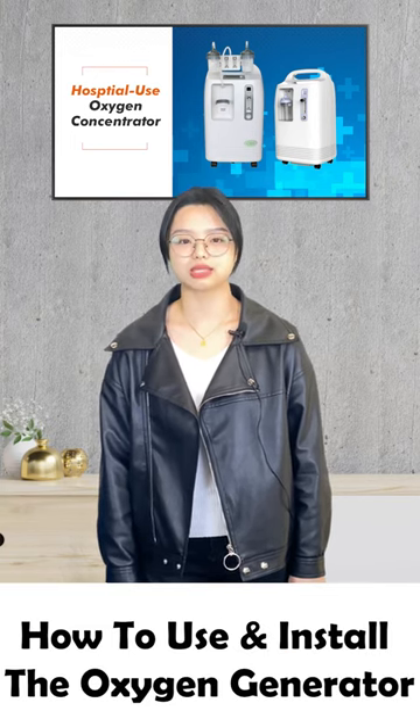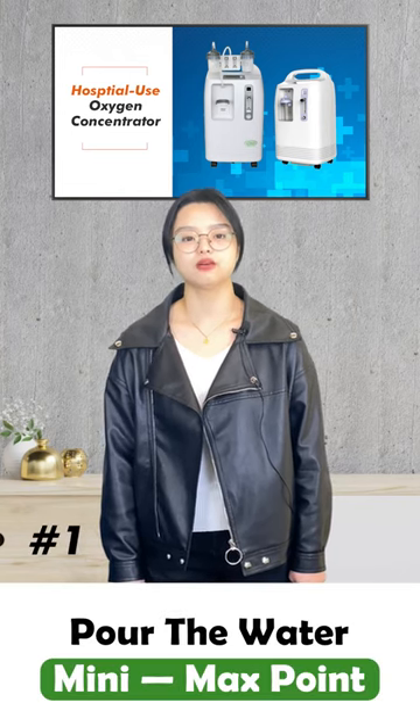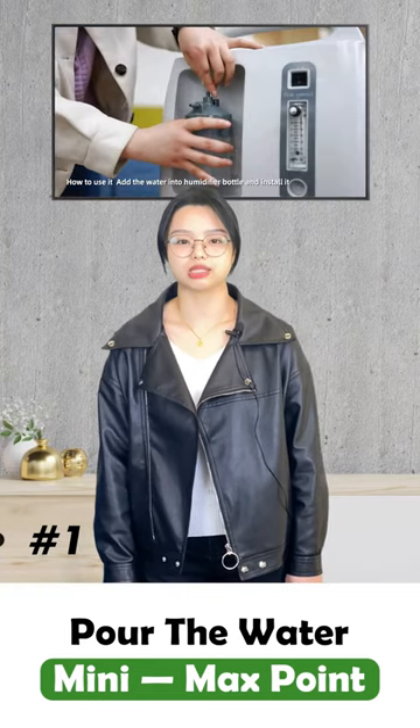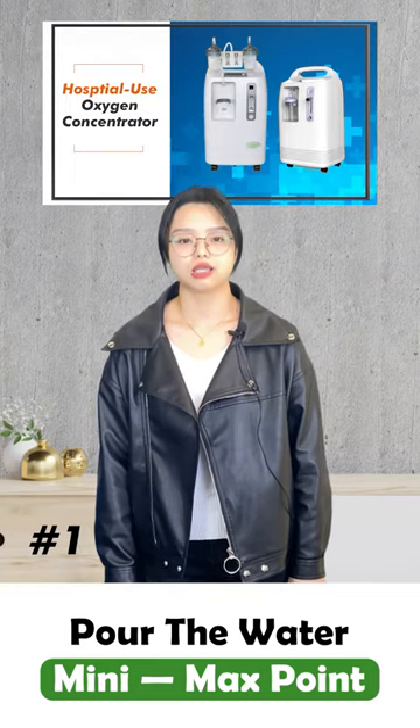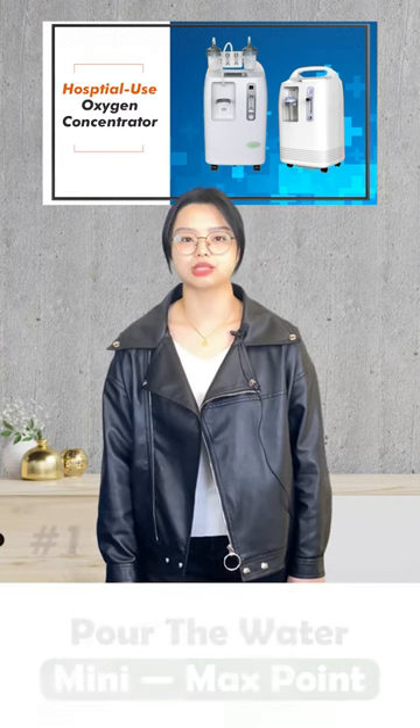Today we will show how to use and install the hospital-use oxygen generator machine. First of all, you will pour water into the humidifier bottle and make sure the water is in between the minimum and the maximum point.